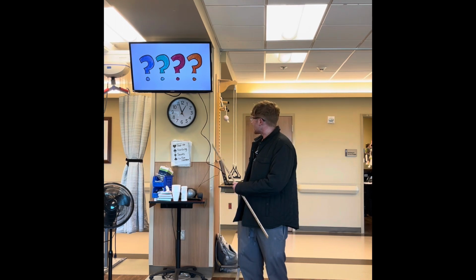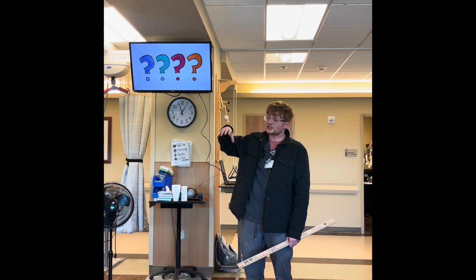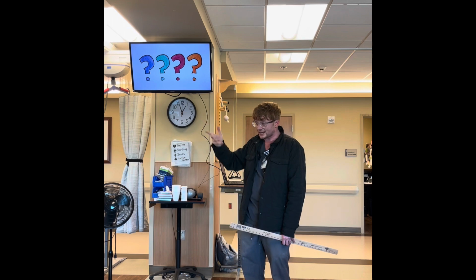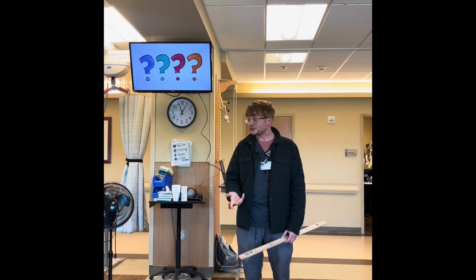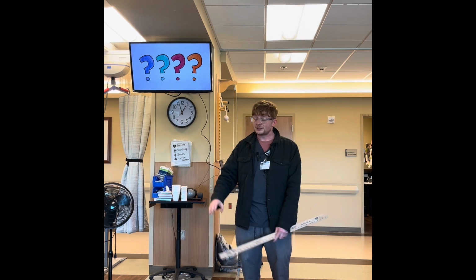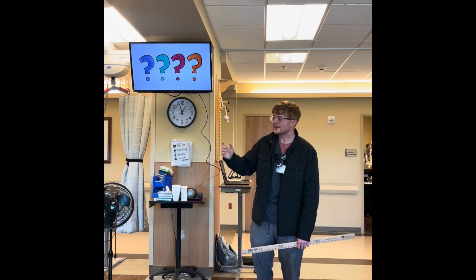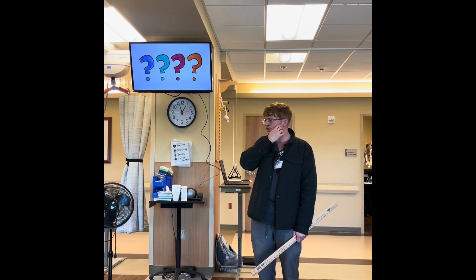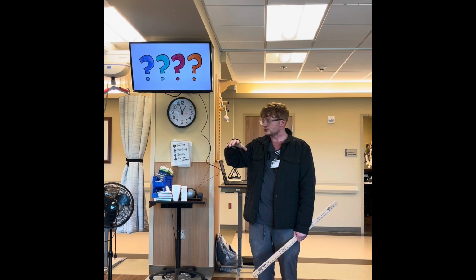For me, what I try to do if I leave strategies is I'll print out a copy of the strategies and leave them with the nurse so that they have them. Whether they refer to them and put them into action, you hope they would. And then I put them on the door sometimes. I think I've been seeing recently they've been a little more thorough with aspiration precautions on the doors, on the acute side anyway, for sure.